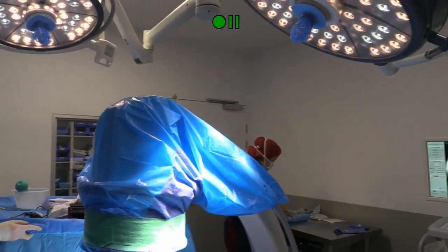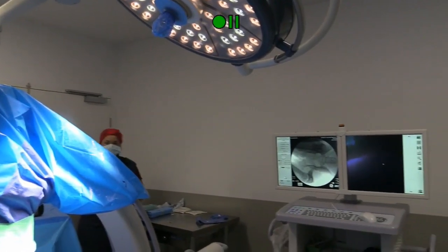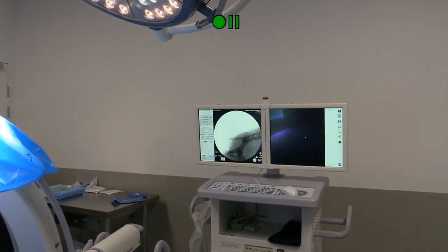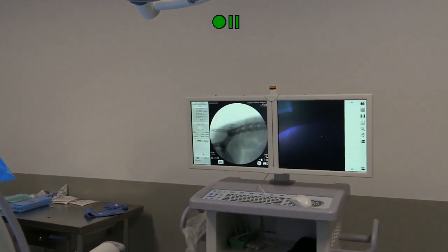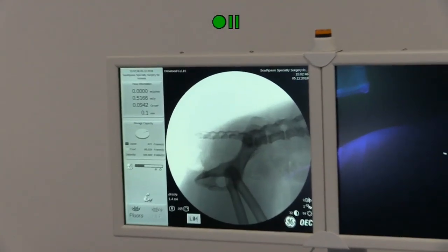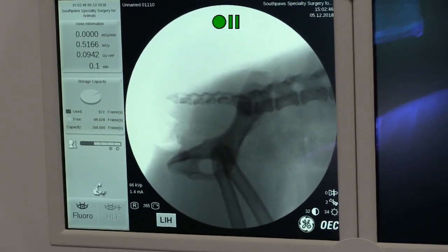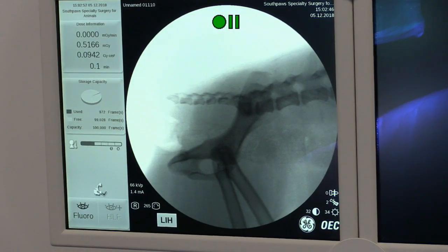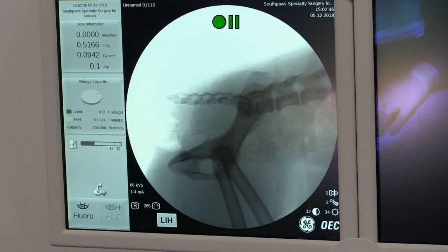So I'm going to start doing some fluoro. You can see here on the fluoro image, we've got a lateral view of the pelvis essentially. The SI luxation is not very displaced, so it should make the reduction and everything else fairly straightforward.